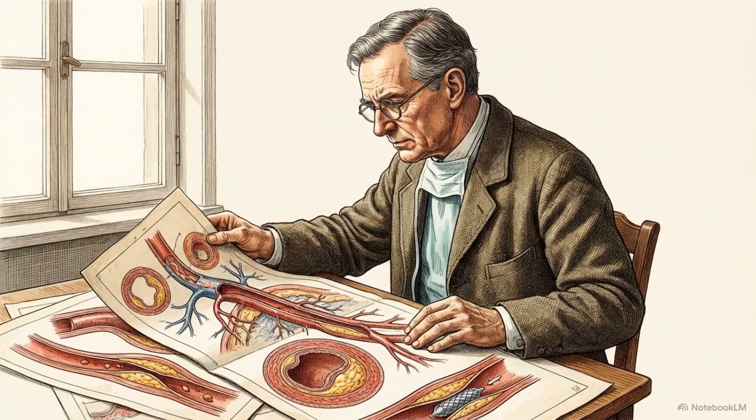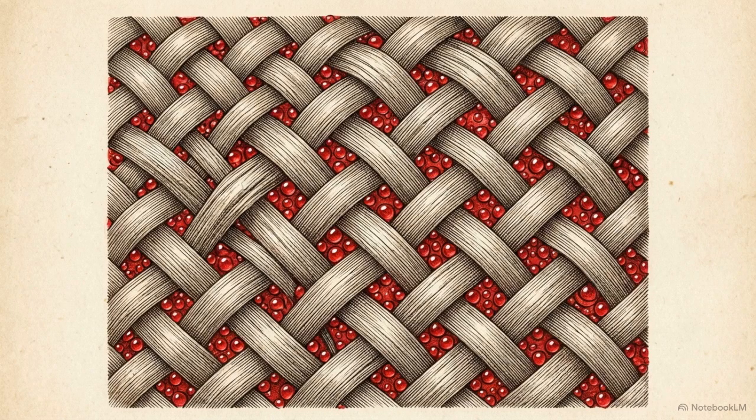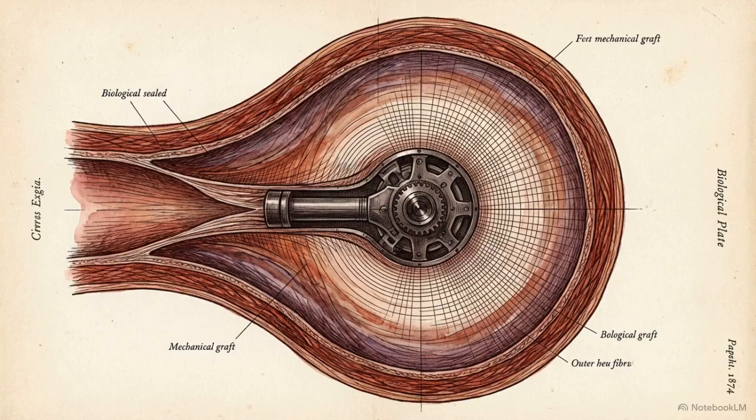Because the pressure is lower, the clinical management for a type 2 is observation. It is actively monitored for at least a year and only requires reintervention if the aneurysm sac physically expands. Finally, there is the historically significant type 4 leak caused by blood weeping through porous graft materials, and the somewhat controversial type 5 endotension. Endotension occurs when the sac grows from the rhythmic pulsation of the graft wall itself, even without a visible flow of contrast dye.